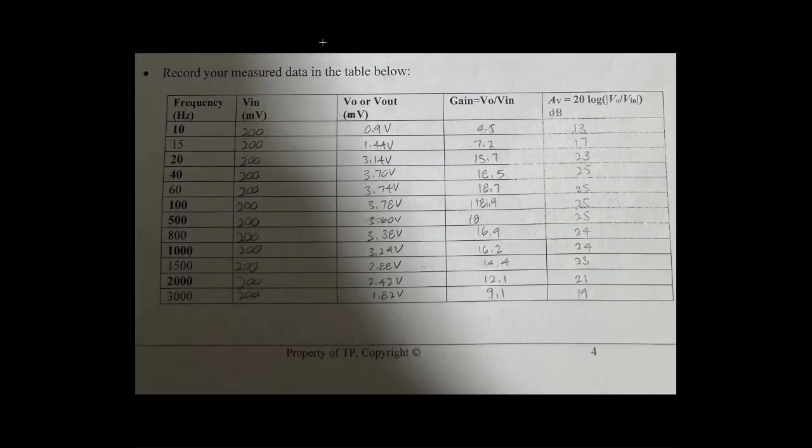The table below shows the data I gathered for V out. I measured TP2 to get V out and tried different frequencies to see how it varies. Notice how the gain does not exceed 23. That's because as we have calculated earlier, 23 is the maximum voltage gain. After that, it is converted to decibels. Next, I crafted a frequency response curve and sure enough, it showed a band pass frequency curve over here.